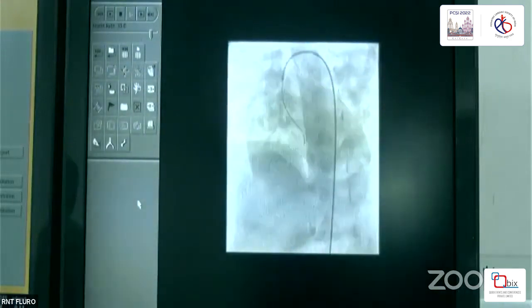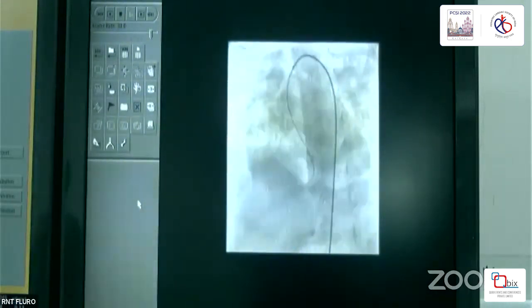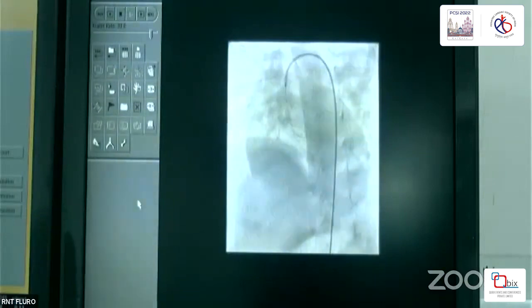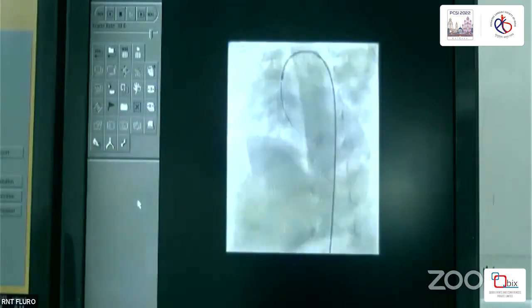Any choice from the audience? We want to know what your strategy is. Are you going to close this defect retrogradely or antegradely? What type of device are you going to use, and what size of device? So, sir, we have chosen a retrograde approach.